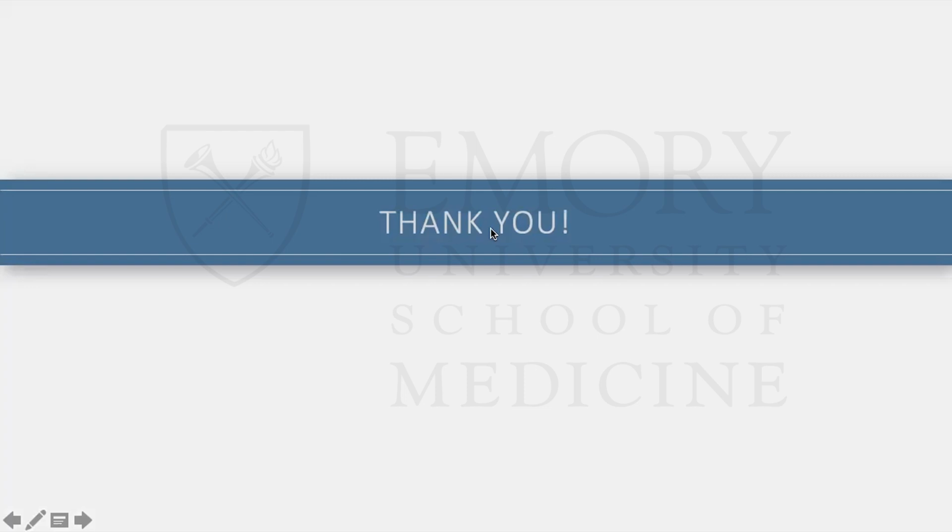Yeah, that's something a lot of our attendings teach us as we're learning to read echoes, that reviewing the chart is an important part of this. It's really true for diastology, because that is where you build your pretest probability. Totally agree with you. Without that, you can start at the wrong branch point and come up with something that doesn't make sense for the patient at all.